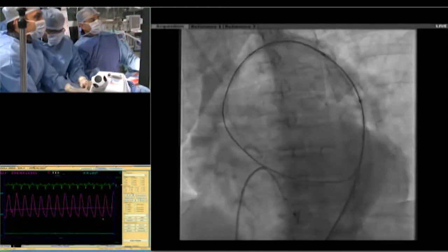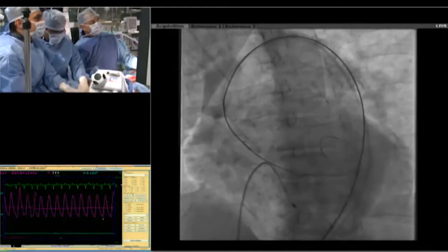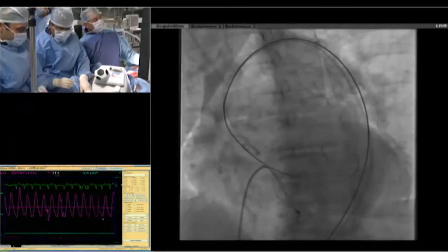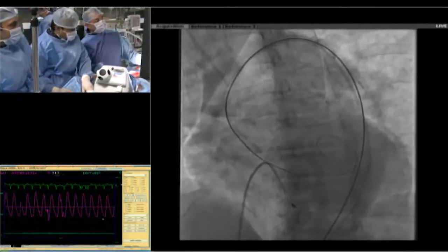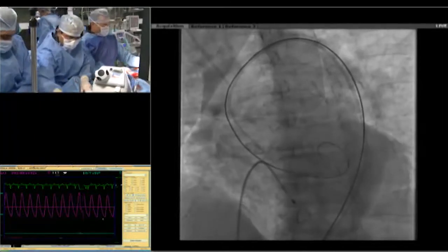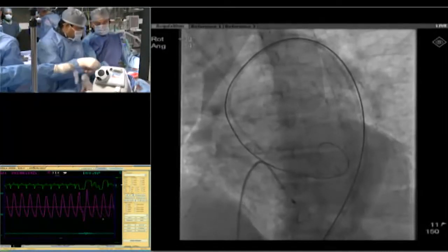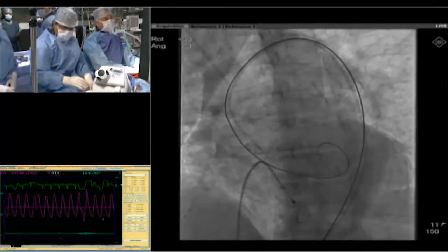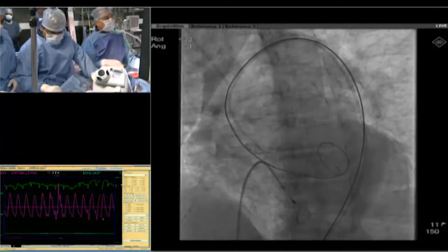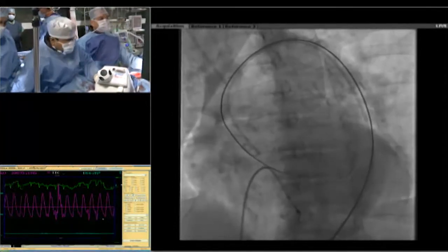So we did that pre-dilatation, and now we're going to put in our 22 French sheath. Barely a pre-dose, almost out. Okay. Can you pull the balloon out? Go to 48 mag now. Show us the wire in the LV, and we would like to see the sheath. Less mag now.